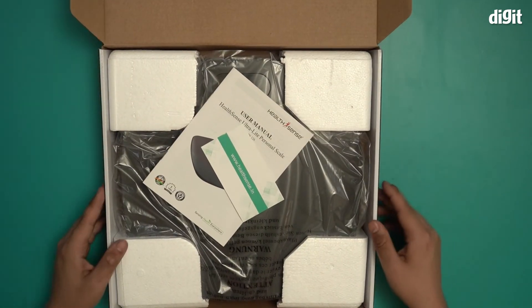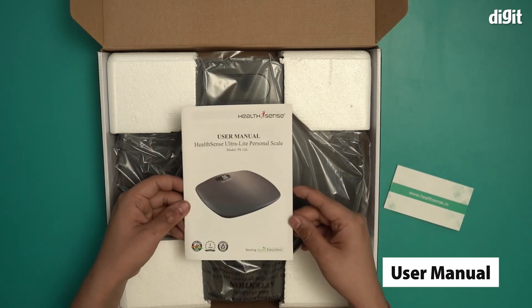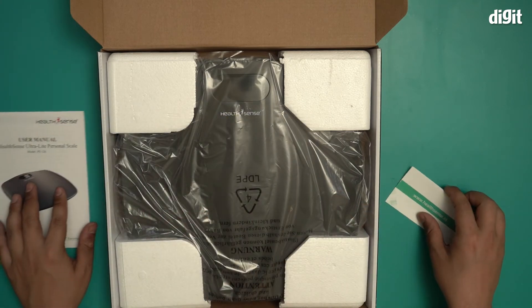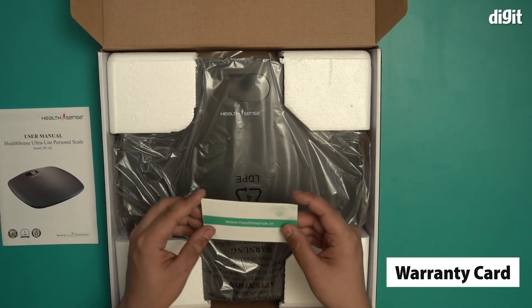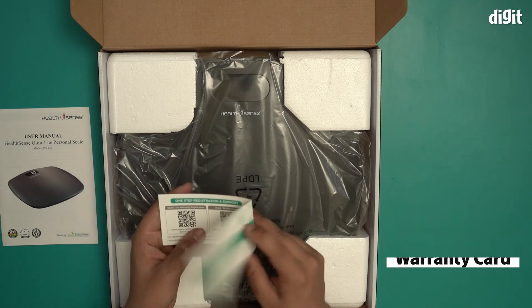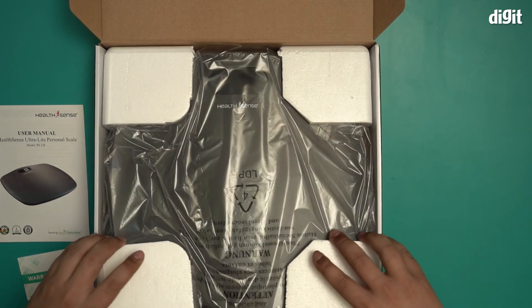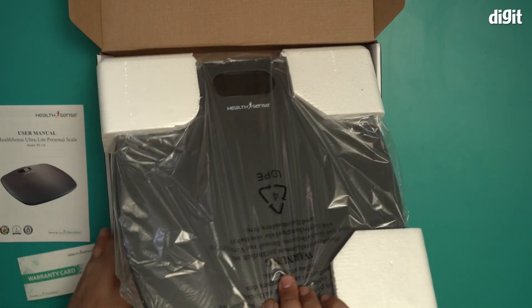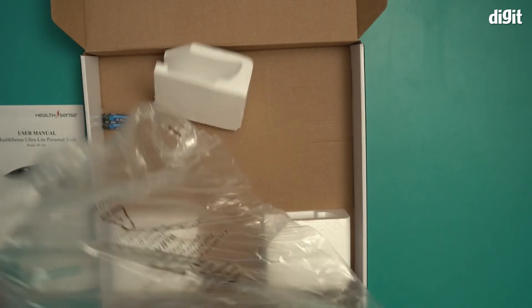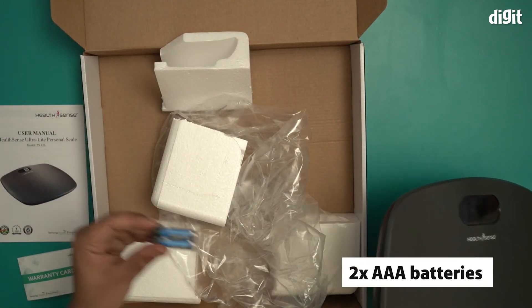As soon as you open it up, you get a user manual, which I would recommend you read. You also get a warranty card with a QR code where you can register. And there is the scale itself, which comes packed pretty nicely. There are also the two alkaline batteries included in the box.